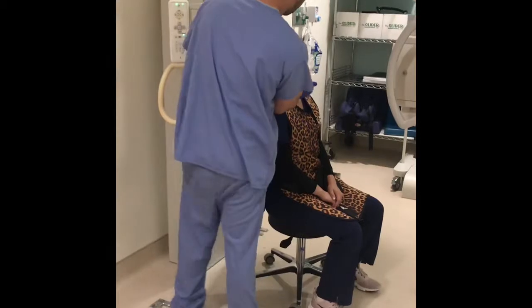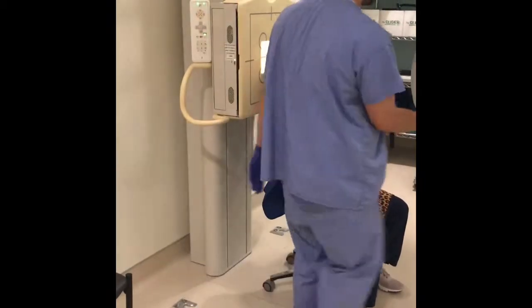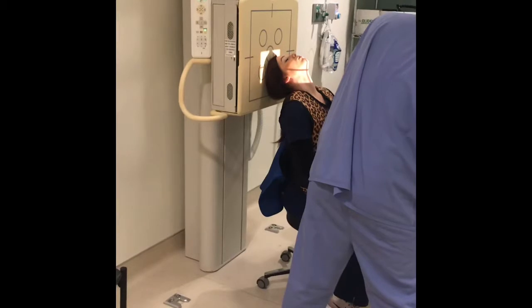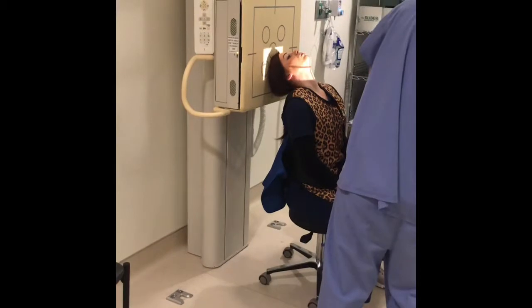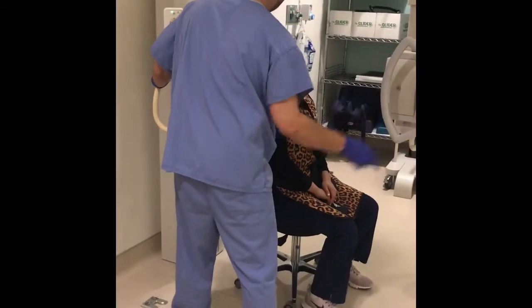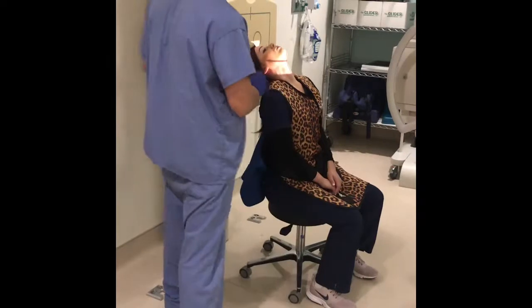So, go ahead and lift your head up and point your chin to the sky. All right, I'm going to lean you back till you touch. There we go. All right, so, super above there, looks good. Oh, see we have tracking on this. Take the tracking off. Careful of your head. All right. So that looks good, and don't forget now that this is our right side.